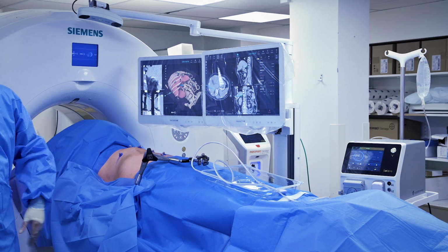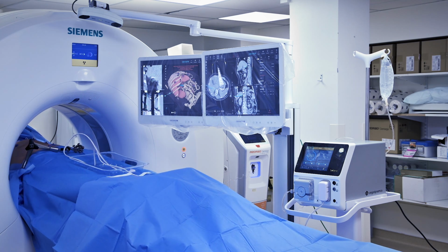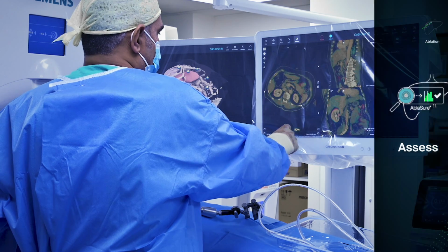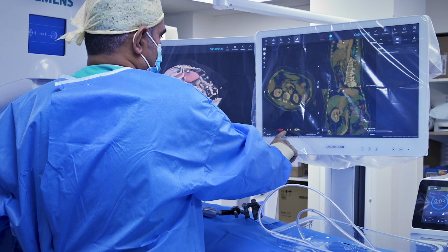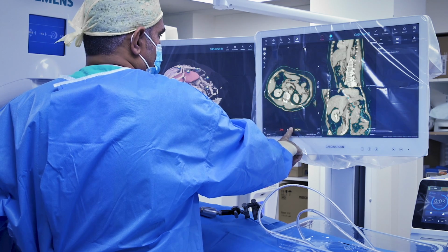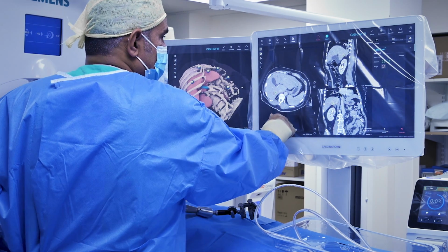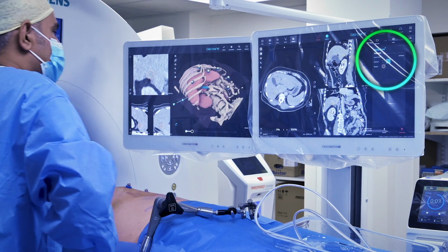Okay, so we're going to do another CT scan now to check what we've burnt. Okay, breathing back on, please. Okay, so once again, we're looking for the image fusion now between the first and the second. Minimal amount of movement, usually looking for the diaphragm edge in the lung. So that looks okay. We'll go to our assessment, and it's found us what it thinks is a reasonable seed point. And we'll let it segment.